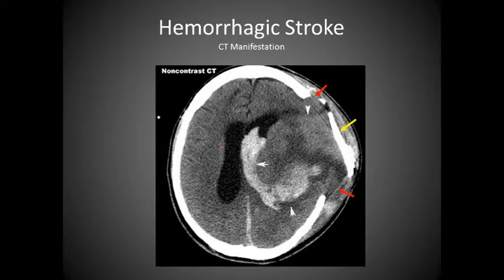Here is a hemorrhagic stroke, and we can say pretty obviously with this that the patient has had trauma. I notice that there's separation here, there's fragmentation, and the brain has come out. Notice there's almost no separation between the scalp and the brain matter. There is a severe midline shift in this direction, and we have the hemorrhage here. We have associated what looks to be widening of the ventricles, which allows us to see that this could potentially be an older patient.